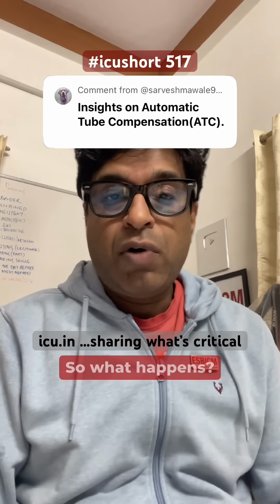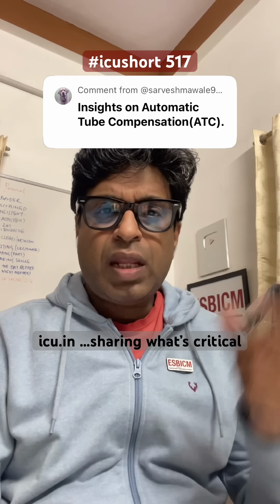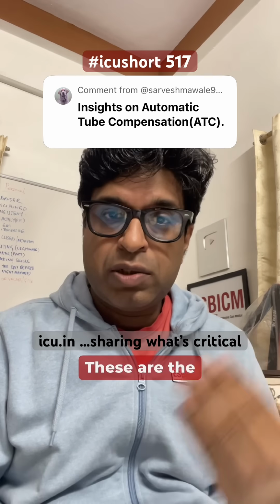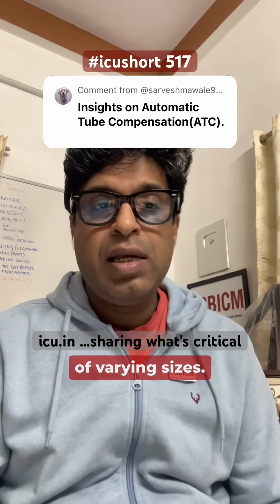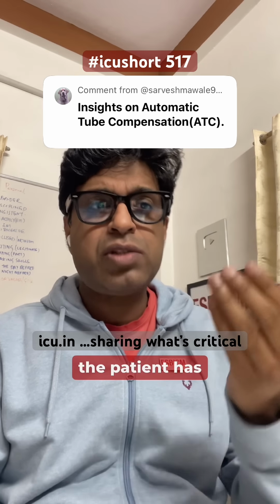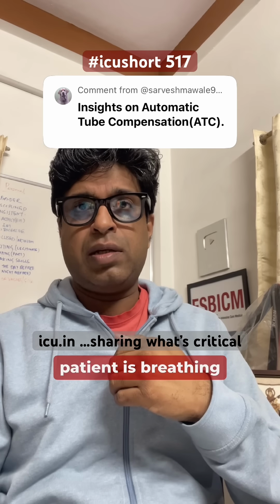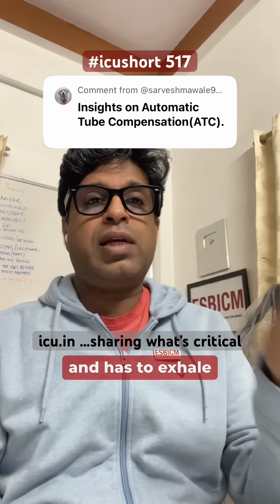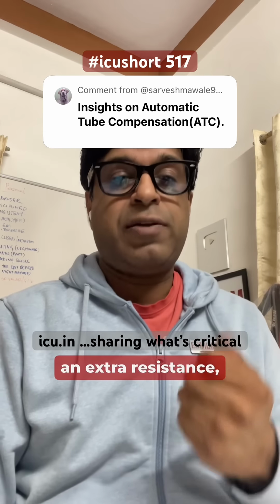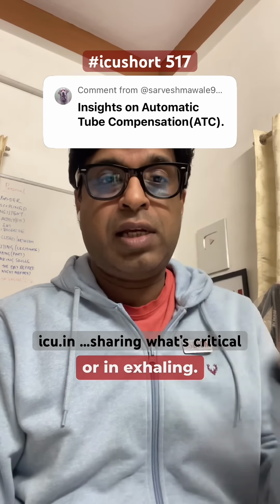So what happens? We all know that there is a tube, which is an endotracheal tube or tracheostomy tube. These are the two tubes, and these are of varying sizes. During inhalation, the patient has to suck the air in, and has to exhale the air through this tube. So it creates an extra resistance either in inhaling or in exhaling.